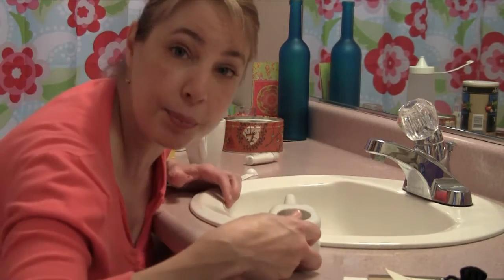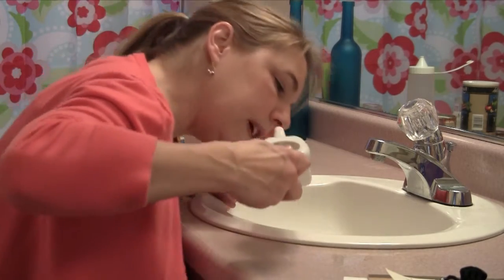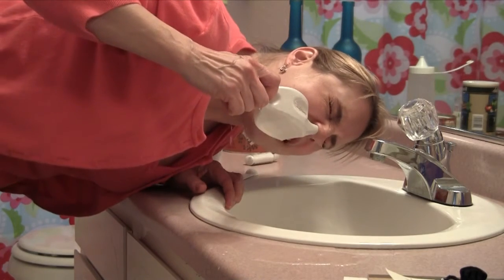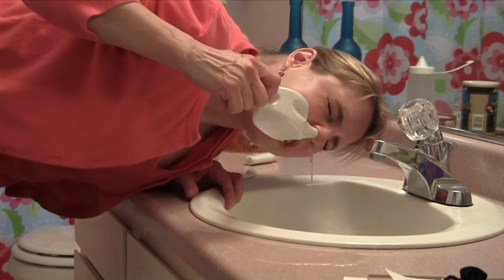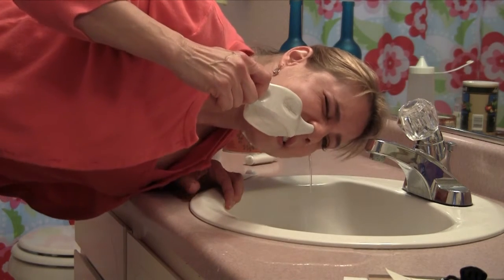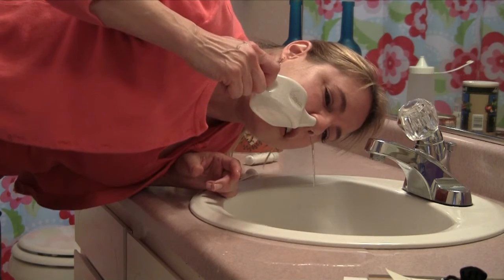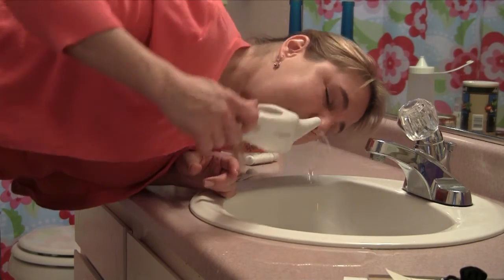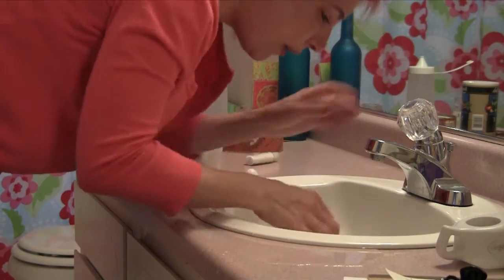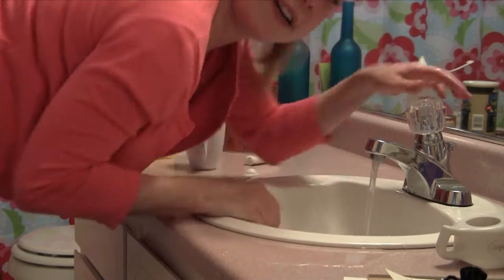I'm going to take a deep breath in, and exhale, it's going to pour in one side and out the other. Okay, here we go. Oh, it's so messy. Oh my God. Oh, I breathe it out. Now, I've kind of done this before, so I'm talking to you. How weird is that? See, it's coming out of the side of my nose? It's going in one side and out the other. And I'm going to just kind of blow out that last bit of water, wash off my hands, and get a Kleenex.